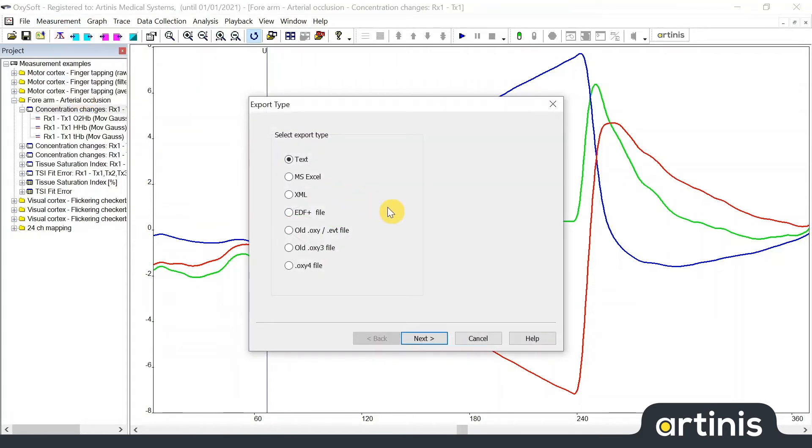The exported file will contain all information about the measurements not only the data including events but also view system and settings. When selecting export measurement the export type window will open.